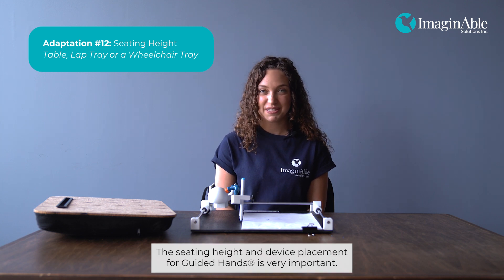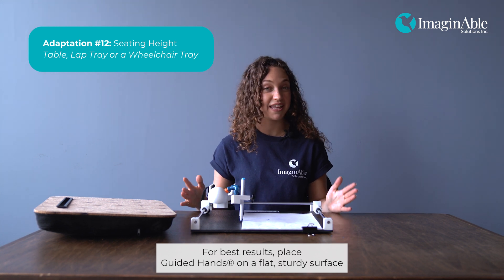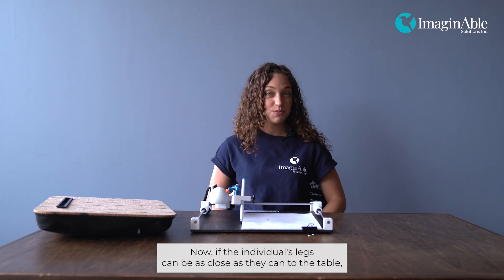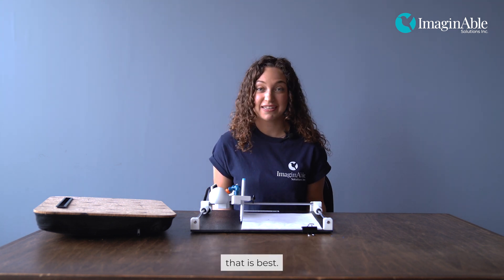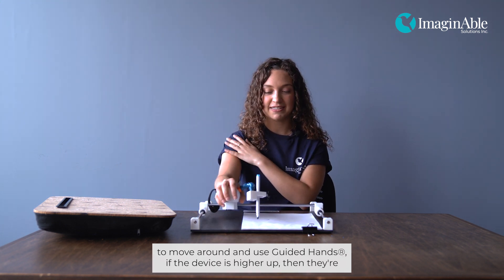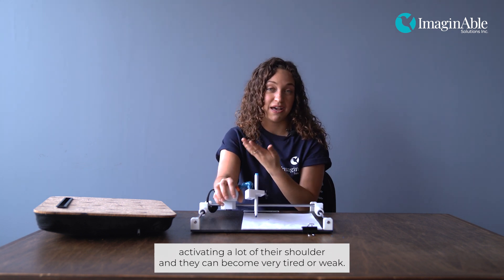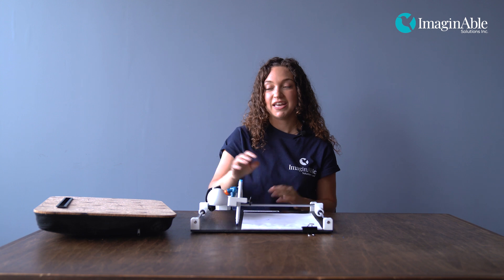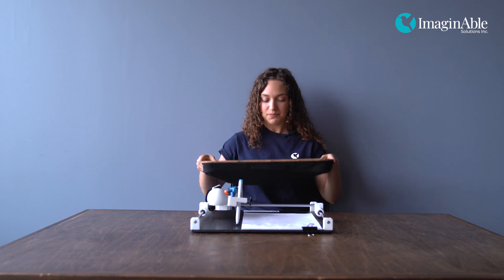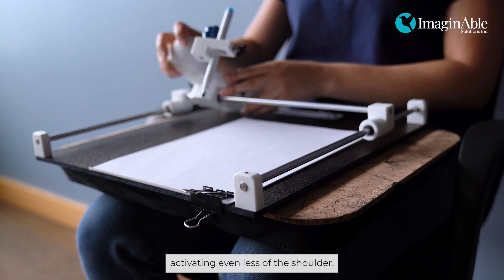The seating height and device placement for Guided Hands is very important. For best results, place Guided Hands on a flat sturdy surface like a table at a comfortable writing or eating height. If the individual's legs can be as close as possible to the table, that is best. Since the individual is using gross motor skills in their shoulder, if the device is higher up, they are activating more of their shoulder and can become very tired or weak. We've also had individuals with very weak shoulders use a lap tray to put the device on their lap, activating even less of the shoulder.